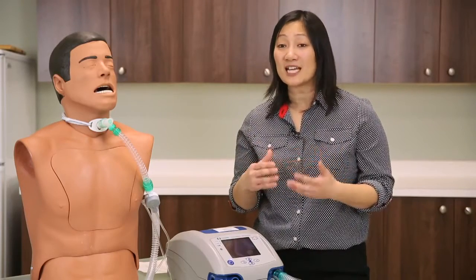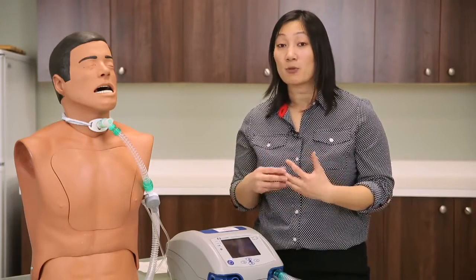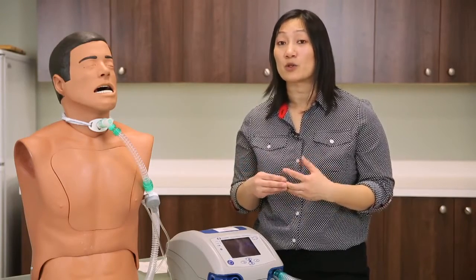If you are unsure or unclear as to how to set your low pressure alarm, please contact your prop RT, and your prop RT can walk through this process with you over the phone.